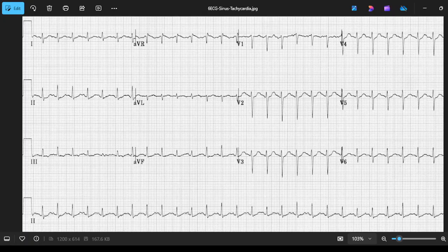And this is not a detailed explanation of how to read an ECG. It is a set of very short tips and tricks with which you can check an ECG and find out what the diagnosis could be, because you have timed exams, right? You need to spend the shortest amount of time on ECG reading. So these are tips and tricks that I found out for myself for my exams, and I'm just sharing them with friends who would want to know. It will be very quick because we don't want to waste most of the time for others.